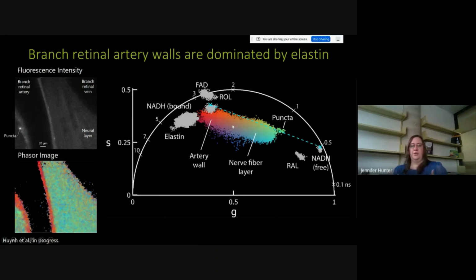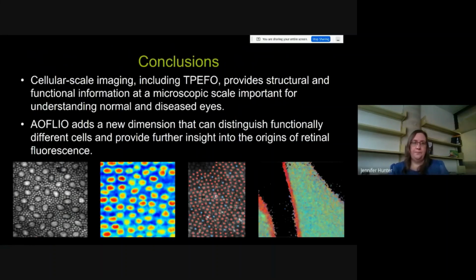And so this is how we can start to understand what's happening and what's changing. Potentially we'd like to move this from looking at monkeys to, here at Waterloo, looking at this in mice, and start being able to look at transgenic mouse models and models of disease that we were not easily able to do within our monkeys.